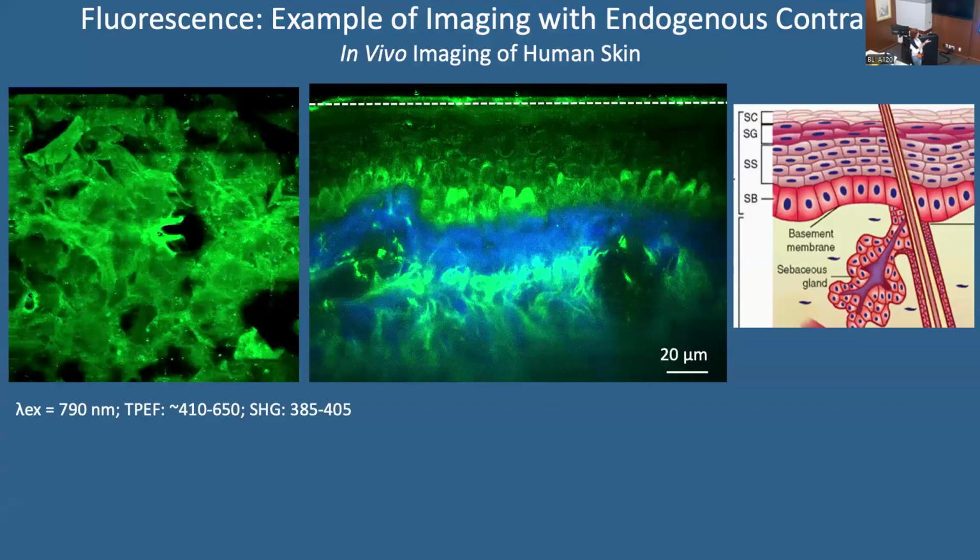In our case, that's an image that Professor Potma also showed earlier. It's acquired in our lab. So just briefly for people who are not familiar with skin, that's why I have this cartoon here, since I'm going to talk quite a bit about it, I wanted to make sure you are all familiar with the fact that the skin is structured this way. We have this cellular structure on top, it's called the epidermis, and the fibrillar structure underneath, including collagen and elastin fibers and all other cell populations.